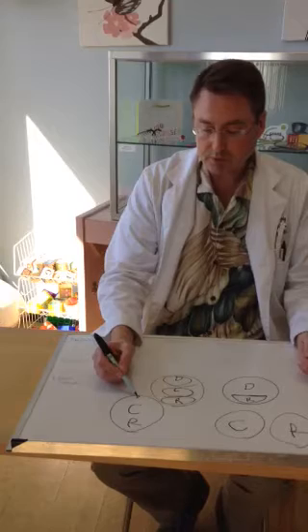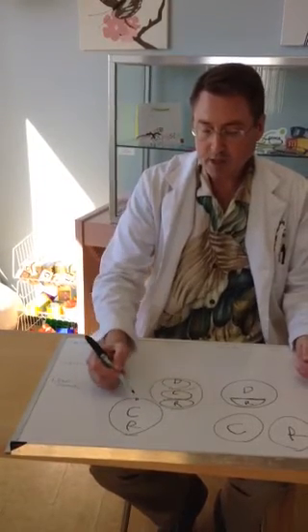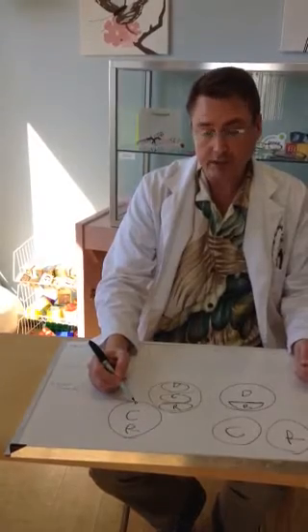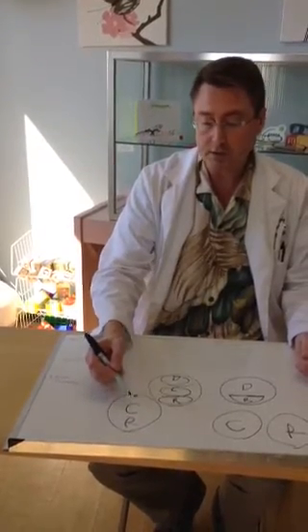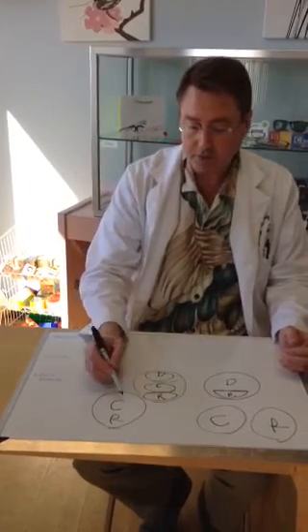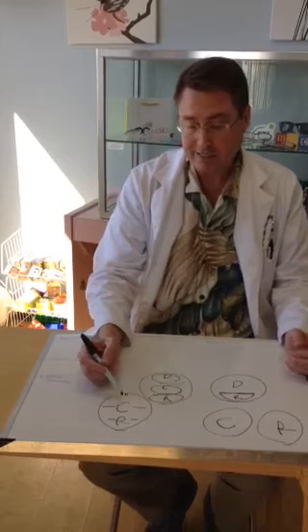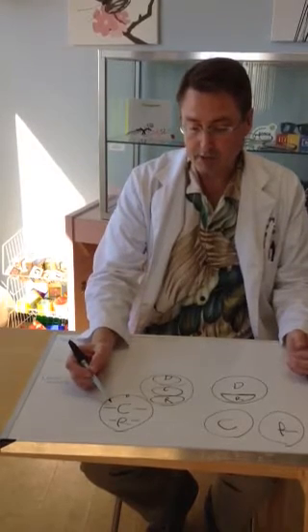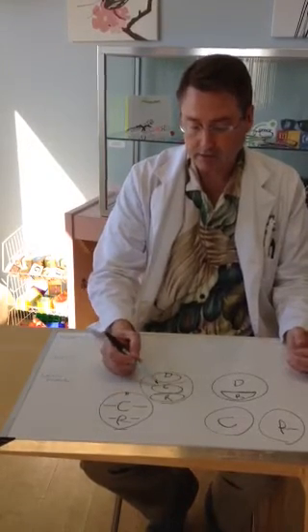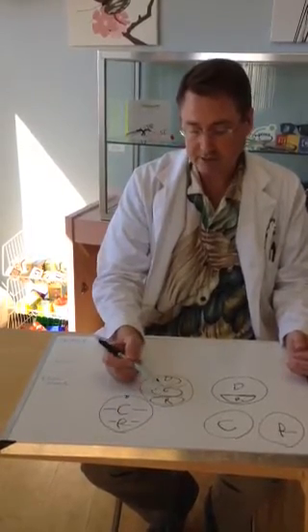This distance component is much smaller, obviously, than the standard. It only works for about 10 feet, but it's easy. You can negotiate around your office, talk to a colleague. The benefit of this occupational progressive is this. That computer portion, that arm's length, is much wider than standard. The reading portion is much wider than the standard.